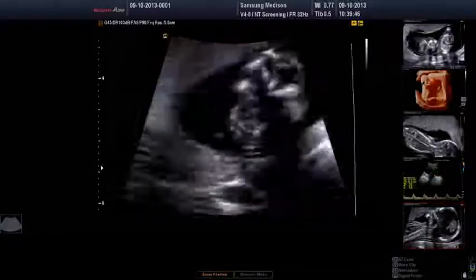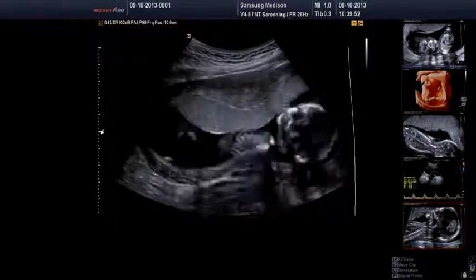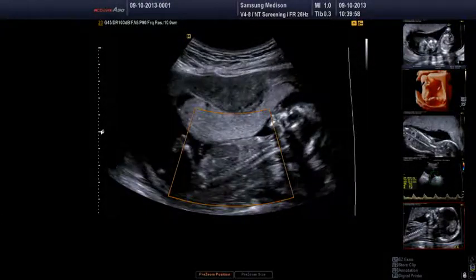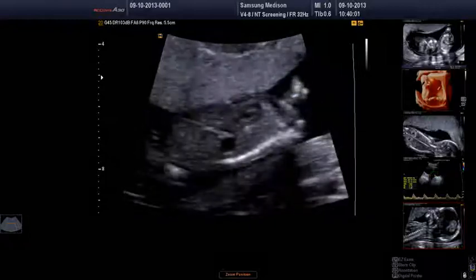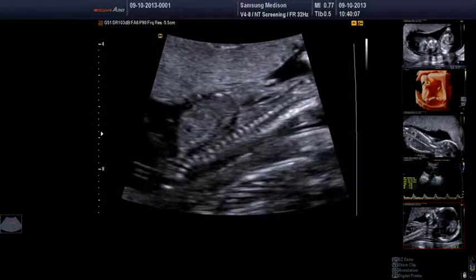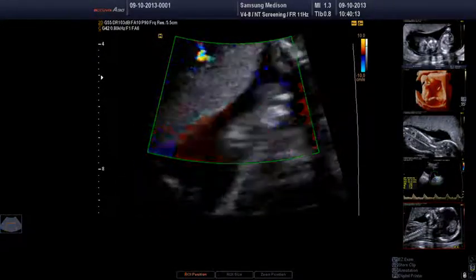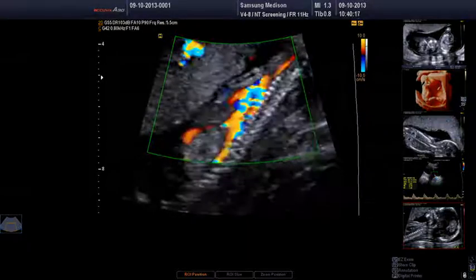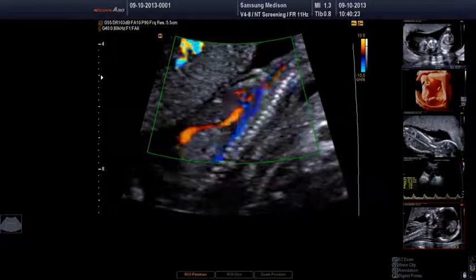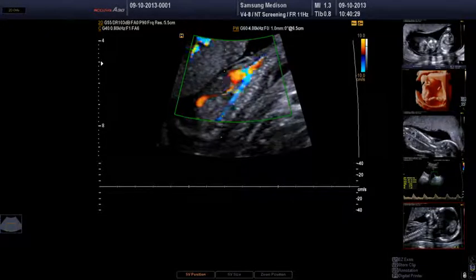So just coming back through, we might see if we can look at the ductal circulation. Let's bring the zoom back up, actually. Okay, so if we put some color on now. Ideally, you want to look at the ductus with a reasonable angle of inclination. So let me try and demonstrate that there. And do you want to just put a gate on? Thanks. See how we go around here.